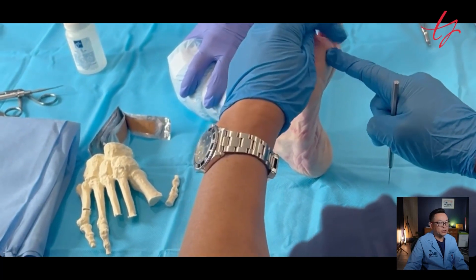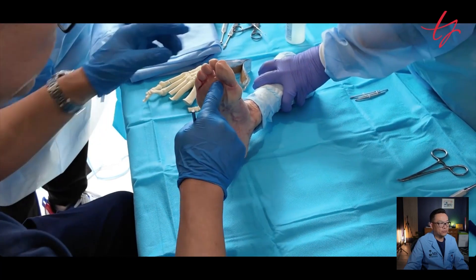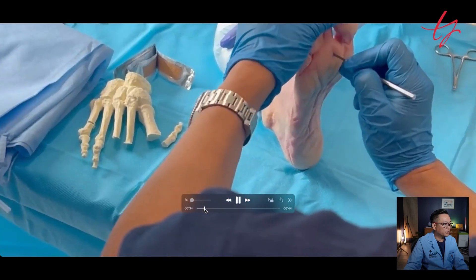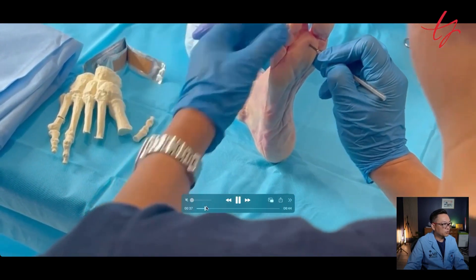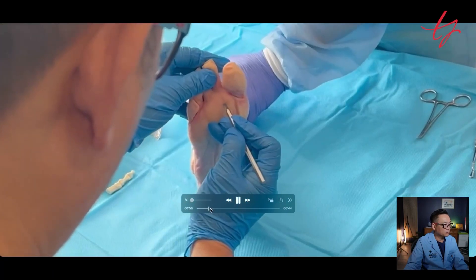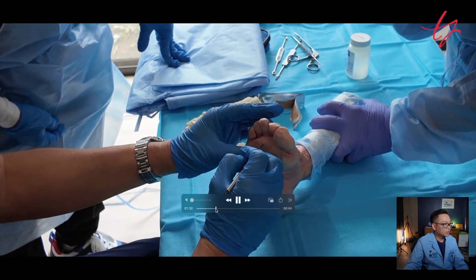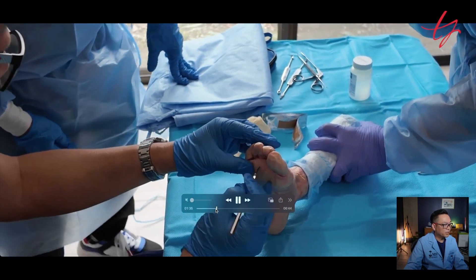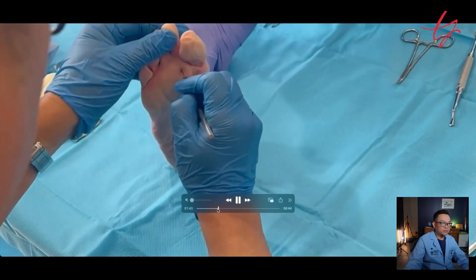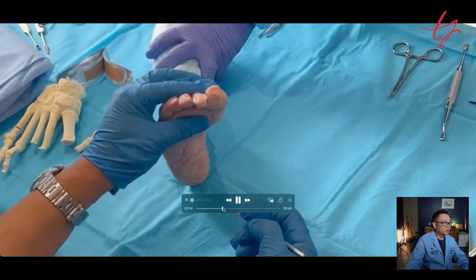This is the plantar approach. Mark the site using fluoroscopy so you know exactly where you're cutting. Then, using a 62 blade, make an incision right to the bone. Then redirect slightly and do the flexor tenotomy right there — the toe becomes nice and loose. I did a third toe flexor tenotomy as well, because my plan was to do both second and third toe osteotomy at the proximal phalanx and middle phalanx. You can see through the flexor tenotomy that the toe gets loose.